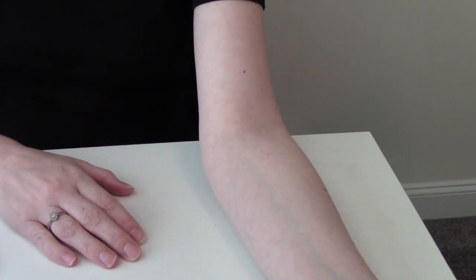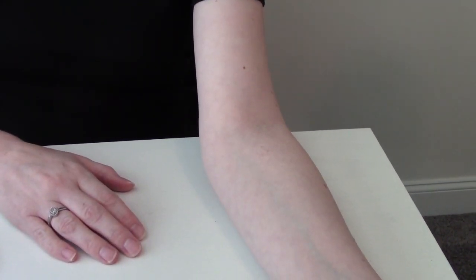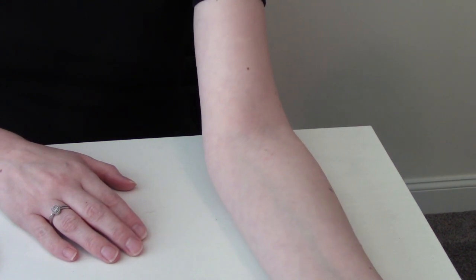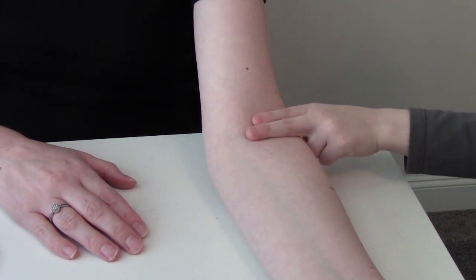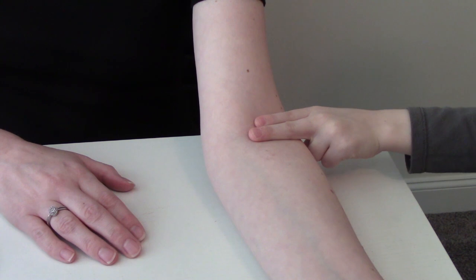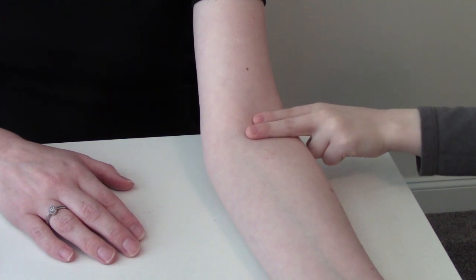When taking a patient's blood pressure, the first thing you need to do is palpate the brachial artery. And once you find it, now you're ready to actually take the blood pressure.